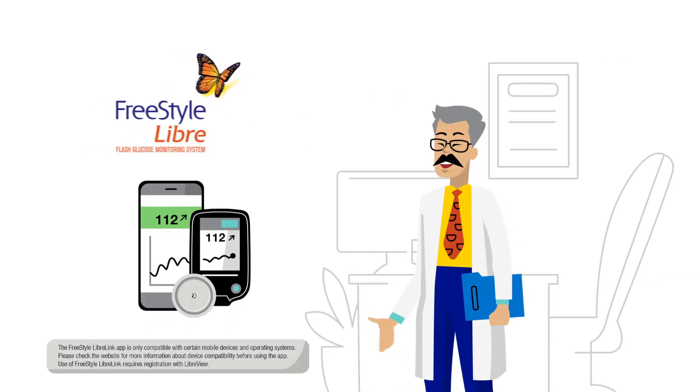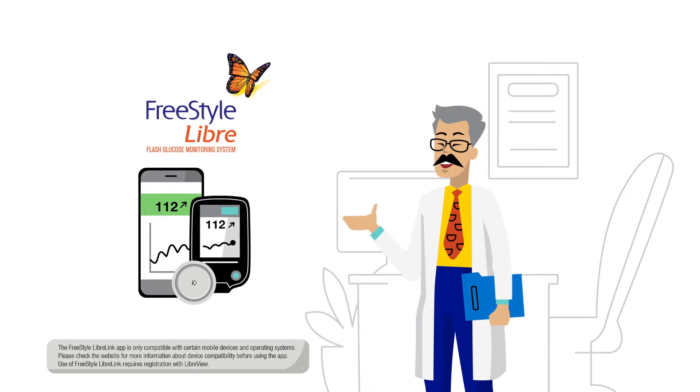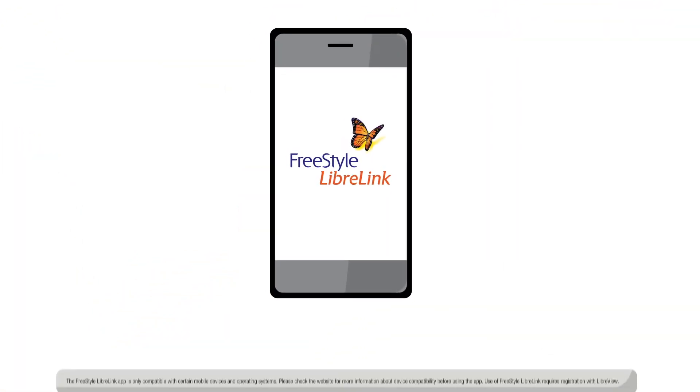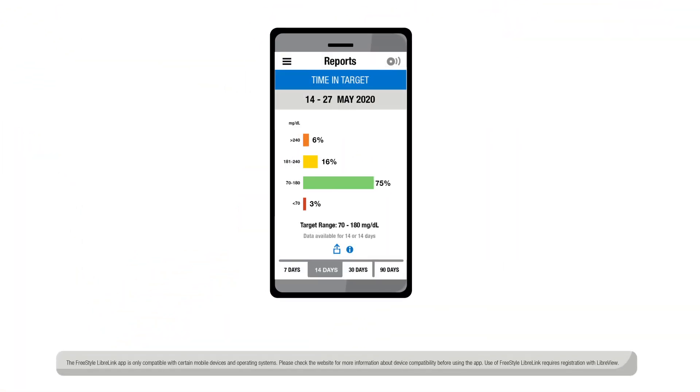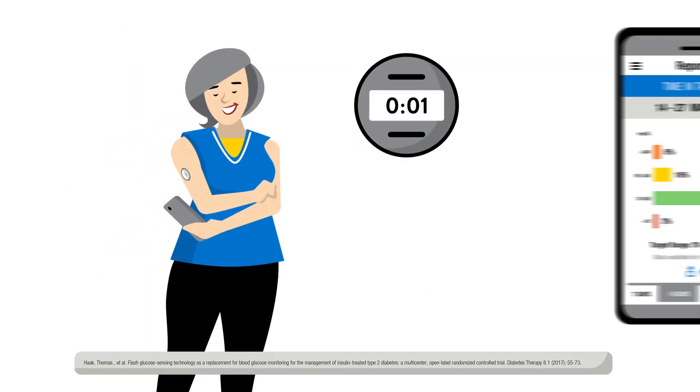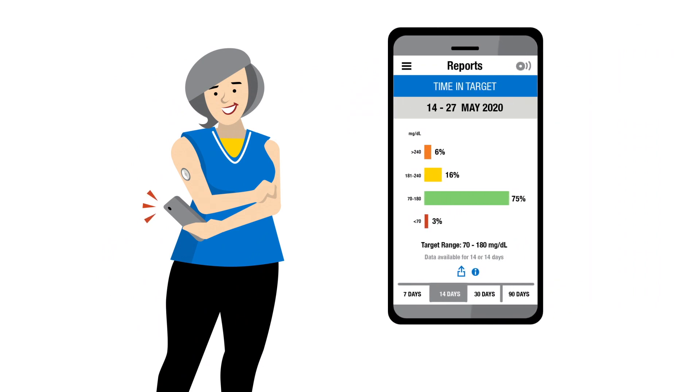Dr. Wu recommends the FreeStyle Libre system as a convenient way for Emma to manage her diabetes. Instead of finger prick testing, she wears the sensor and uses the FreeStyle Libre link app to view her time spent in range over a selected period. The scan is quick and painless, with the device automatically calculating the percentage of time spent in, above, and below her target range.